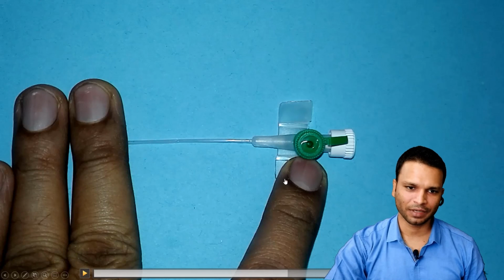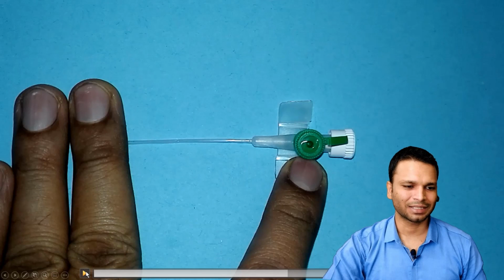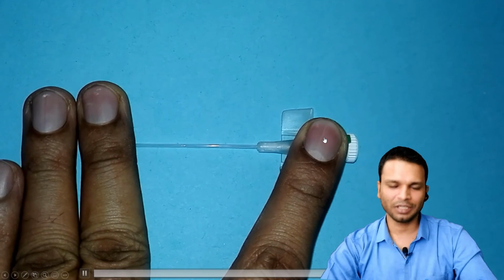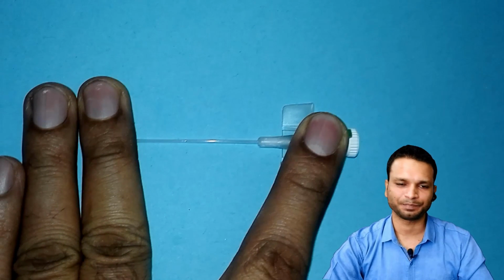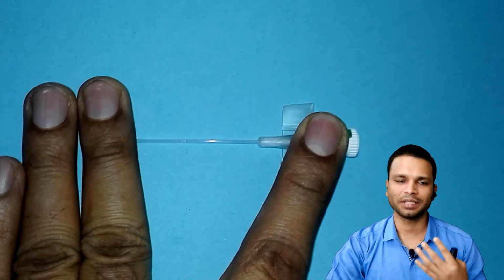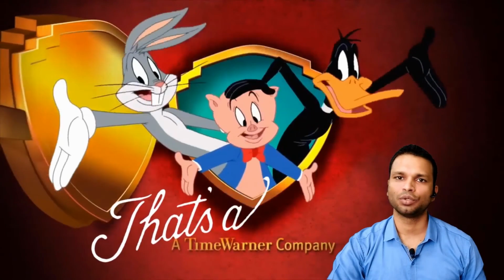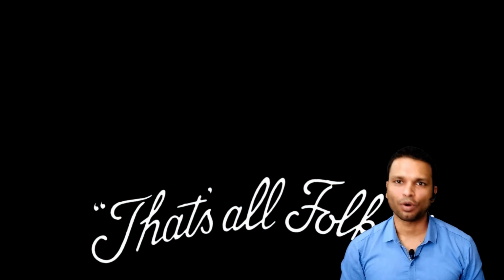Now what I prefer is I don't apply pressure over the wing region, I apply pressure over the injection port. That is a far better method because it firmly fixes all of the cannula over the skin. It doesn't move at all. So in my experience, it is far more secure. So that's it. That's all, how to place an IV cannula. I hope you guys learned from this small video.